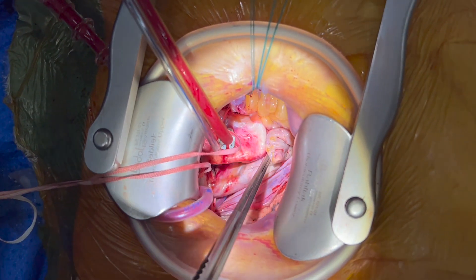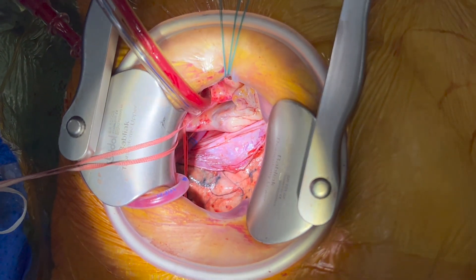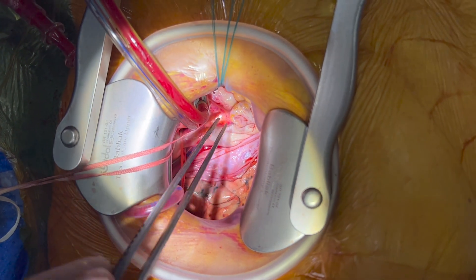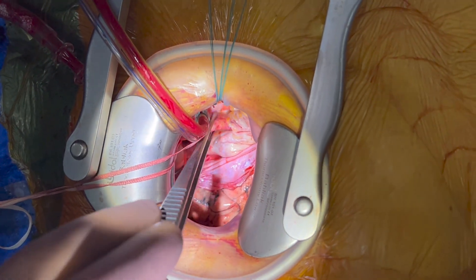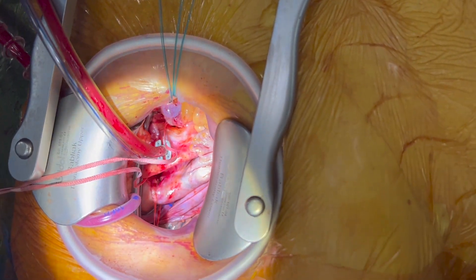To see the difference: when the surgeon releases the SVC tape, the aorta and aortic valve will go back to the left under the sternum. And when the surgeon pulls the tapes again, the aorta comes back into the operation field.